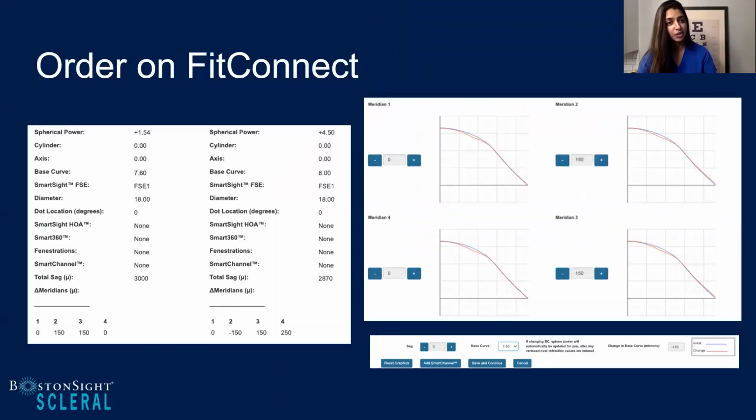So I went ahead and logged on to my Fit Connect. I utilized my diagnostic lenses, brought them up, and made some minor changes. This is a demonstration of the beautiful graphical program that we have on Fit Connect, where we can look at each individual haptic. There were some adjustments on the right eye where I flattened my meridian 2 and 3 by 50 micron steps to a total of 150.